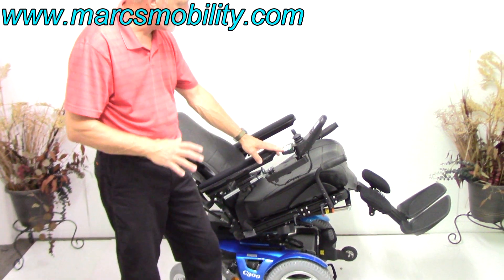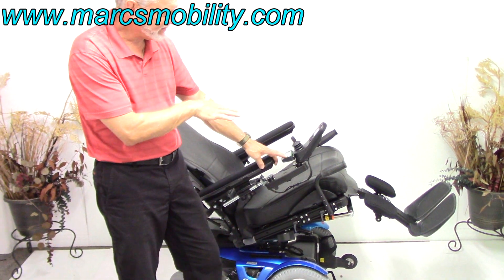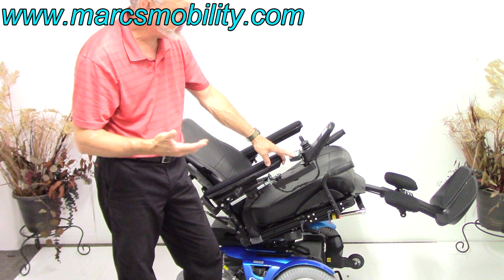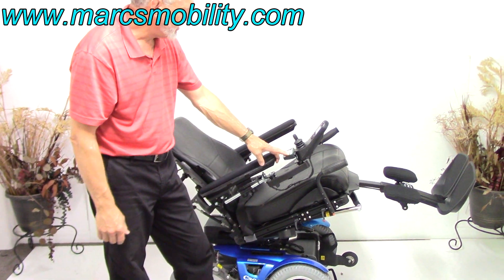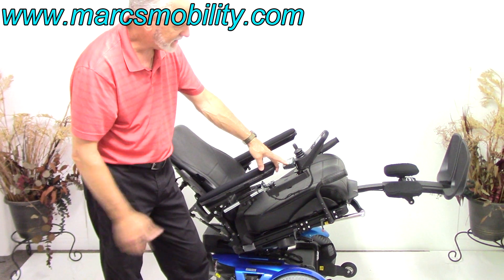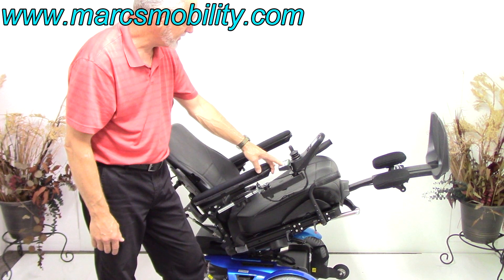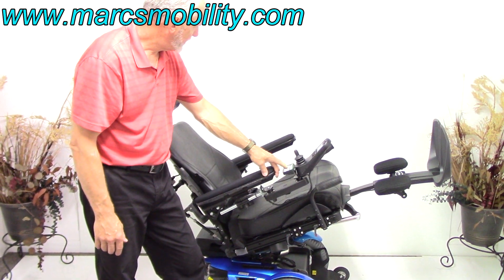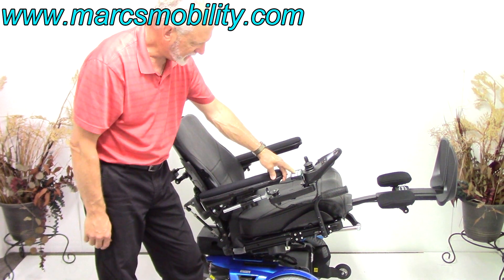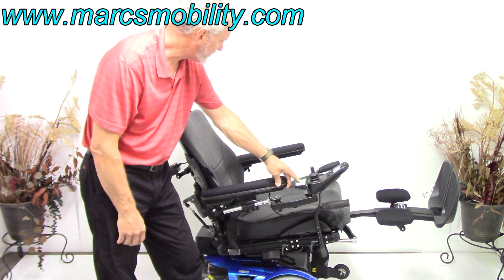If you want to be tilted with your legs higher than your body, you could leave the seat halfway tilted and raise the legs up — you'd have your legs higher than your body for circulation. You don't have to be tilted this far back. I'm raising the legs now — the legs can go up on their own, you don't have to be tilted. You can bring the tilt back to whatever level you want.